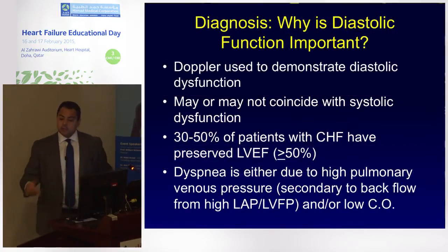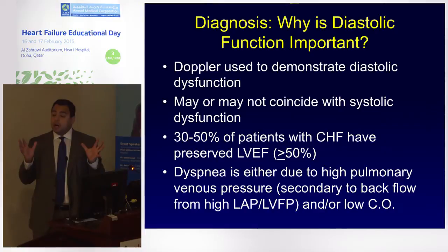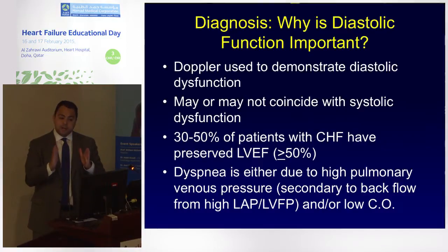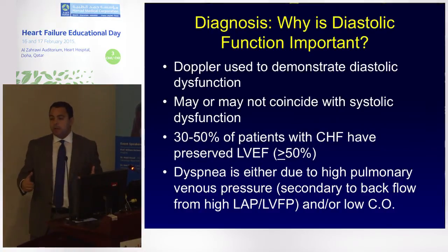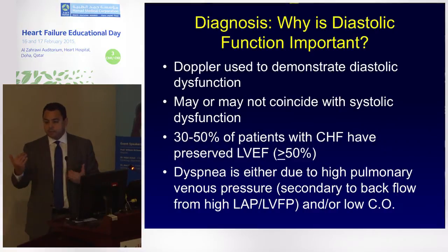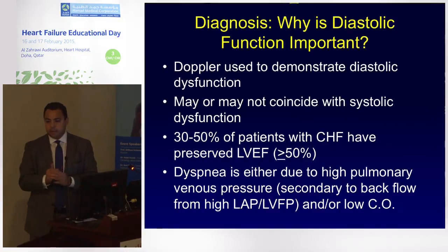So why is diastolic function important? We talked about 2D variables. Let's shift now to Doppler variables. As I mentioned before, filling pressures are critically important. But one caveat, Doppler is an instantaneous measure. So if Amr admits a patient with decompensated heart failure and orders an echo, and the echo is done 4 days later, Amr has started the patient on IV nitro, given them an IV Lasix drip, brought down their preload, started an ACE inhibitor, brought down their afterload, and now they are near euvolemic. If I do the echocardiogram at that point, the filling pressures may be normal. That doesn't mean they don't have heart failure. It means that there have been changes in the hemodynamic milieu such that their volume status has markedly changed.